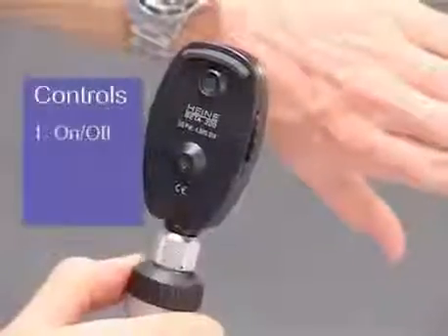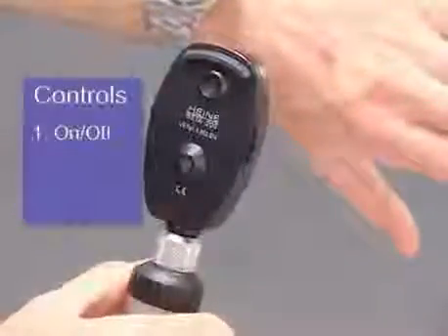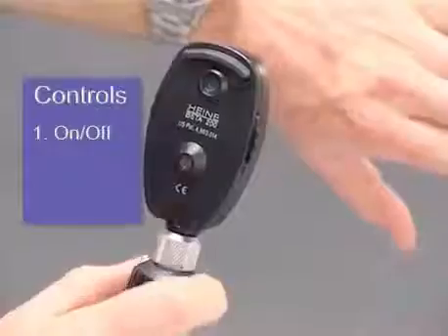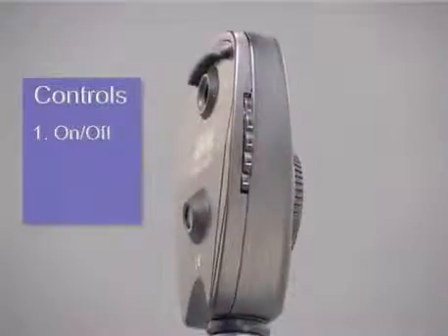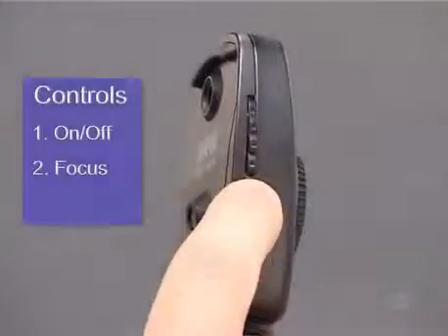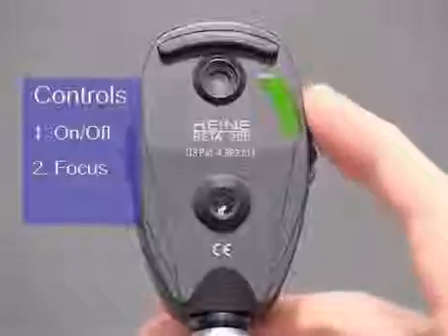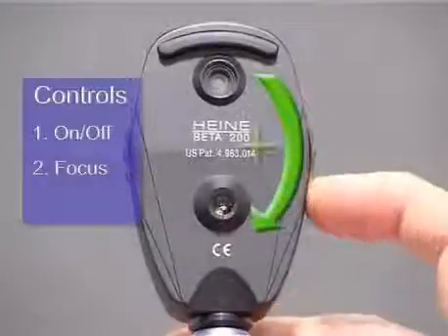There are three basic controls that are common to all modern ophthalmoscopes, regardless of their design. Firstly, there's an on-off switch, which also controls the brightness of the light and is usually found on the top of the handle. Secondly, a lens wheel which adjusts the focus. This is mounted in the head of the instrument and carries a graduated range of lens powers around its edge. Dialing this wheel clockwise increases the lens power.